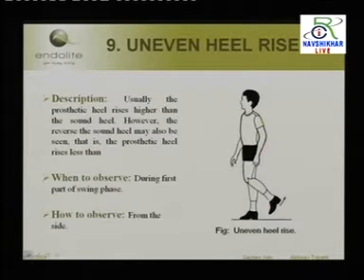So if you have the right amount of friction at the knee joint, and the right cylinder fitted at the knee joint, it allows him to bring the prosthesis forward. Again we come back to our original story, what an amputee wants. He wants the system to be there at the time of heel strike. If it is not there, he will fall. So all amputees and all professionals work on these lines, that the system should be there at the time of heel strike. He should not be thinking about whether the system has reached or not.